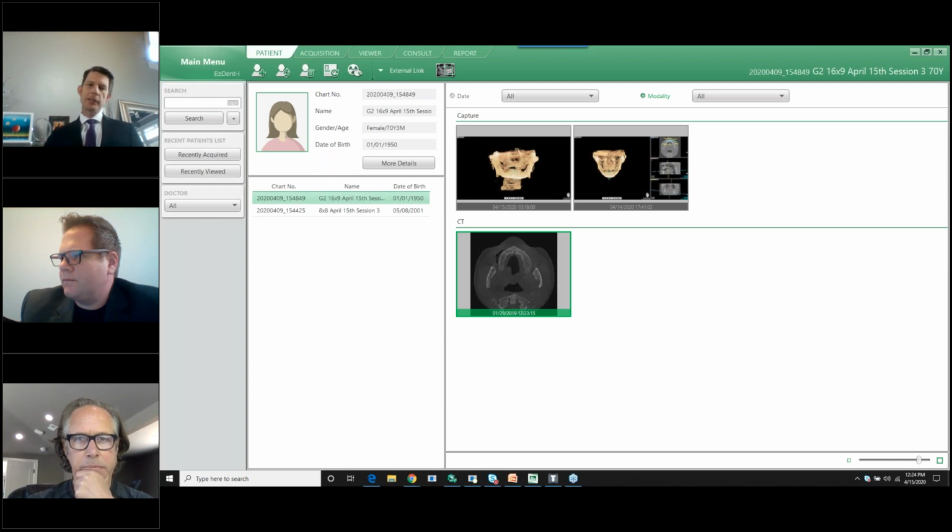I'm going to refer them back to your webinar sessions, the April 1st one and the April 15th one. We did cover that comment on AP spread, and I know you'll talk about it on your April 20th session and maybe even on the 22nd. So tune in next time for that one. We have covered that question.